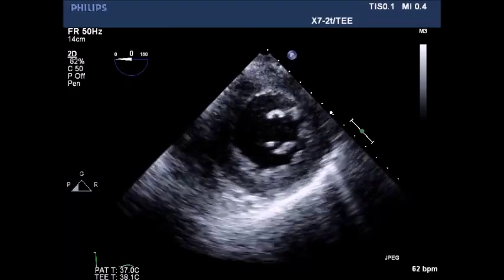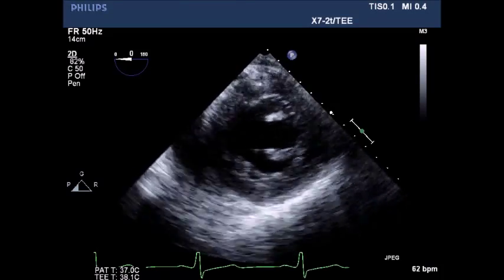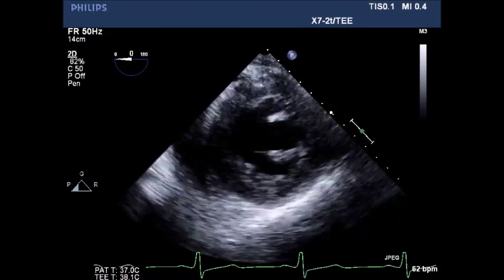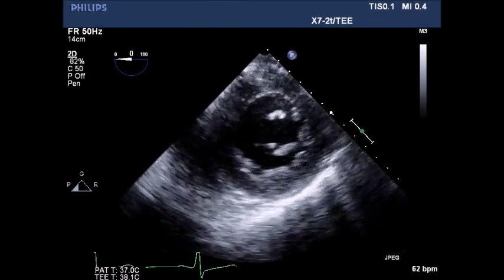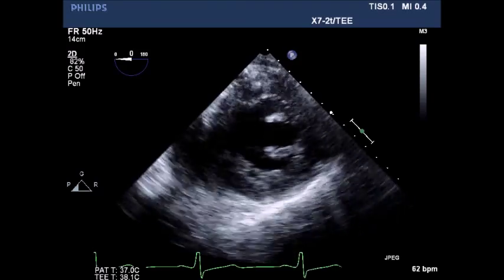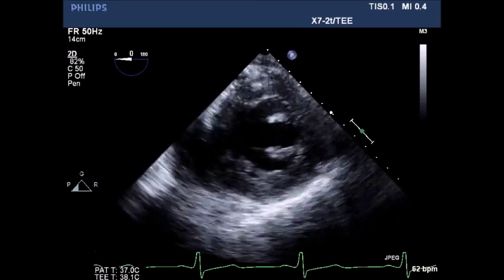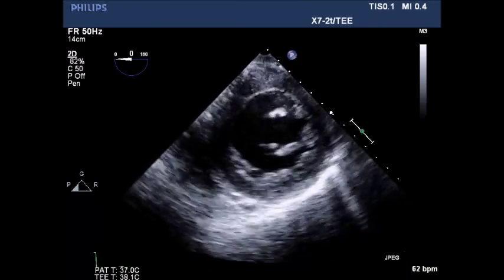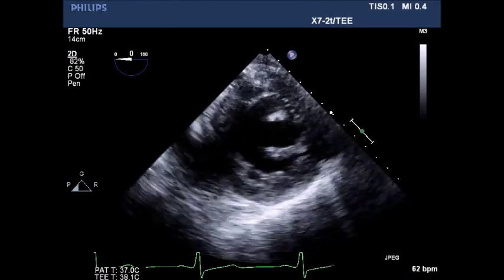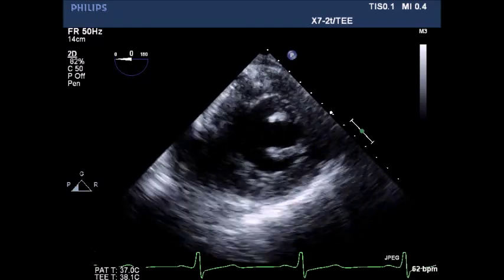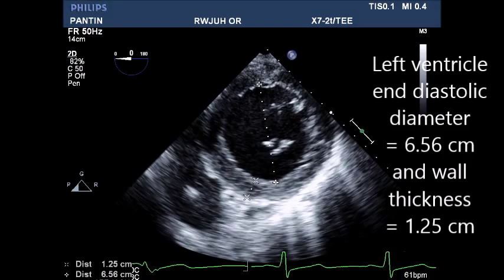Transgastric view of the LV — note dilated LV cavity, thickened wall mass, and decreased contractility. LV end-diastolic diameter was 6.56 cm and wall thickness was 1.25 cm.